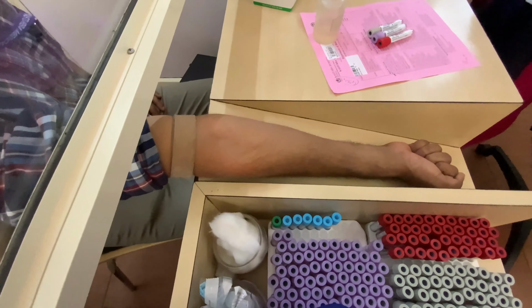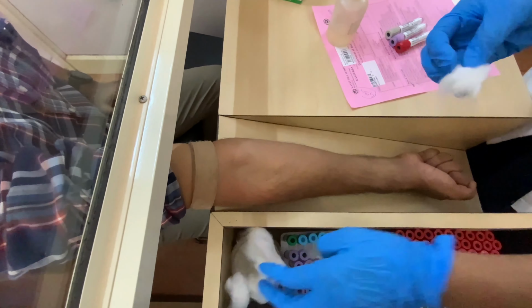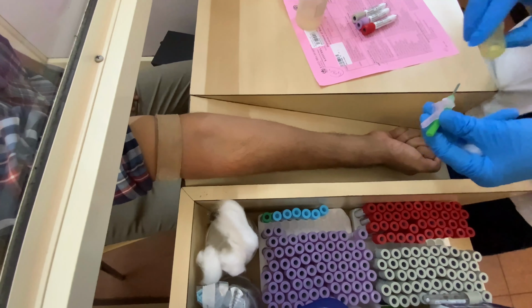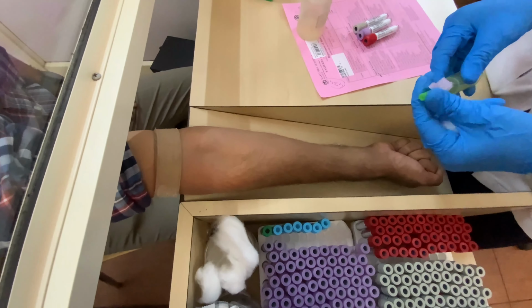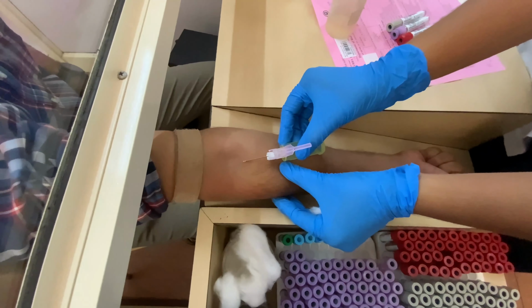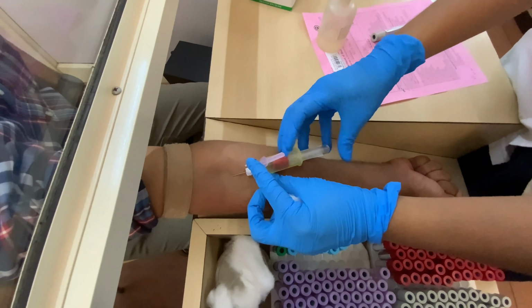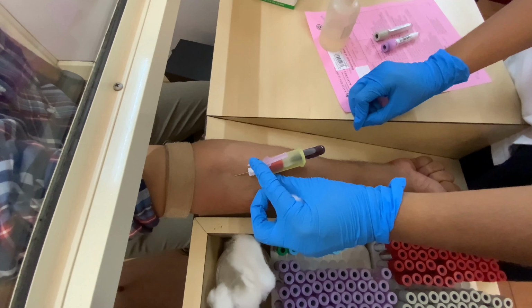Vein is visualized and pricked with a freshly opened sterile needle and the blood is collected in the relevant vacutainers in the order of draw.